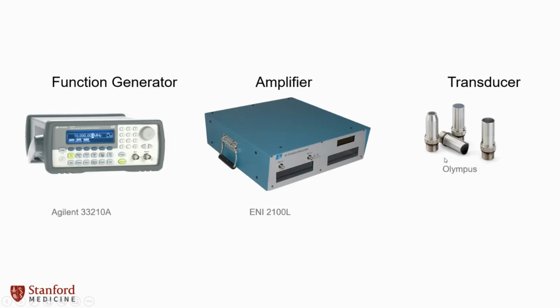And then transducers, oh man, there's really a lot of options for you out there. I actually think I have a shot here. When I was looking at different transducers, there's a company called STEM Inc. They make these curved, or not, I guess, curved single element transducers. These are like little piezos that have a natural focus at a given depth that you could look at. I mentioned rings having a natural focus relative to the internal diameter. Tons of companies make these rings. With both of these, you would basically attach a positive and a negative to either side of this element and then just oscillate the voltage, and these will expand and contract and emit ultrasonic pressure.